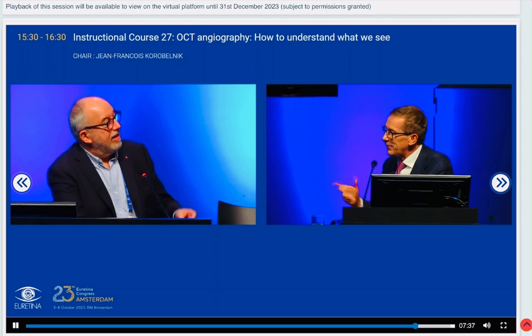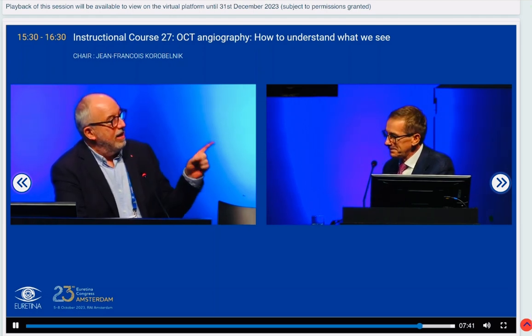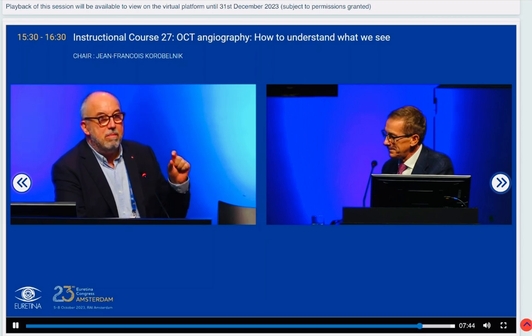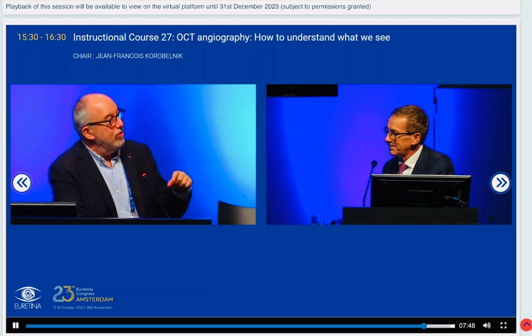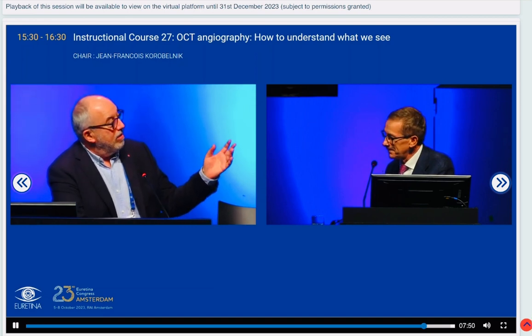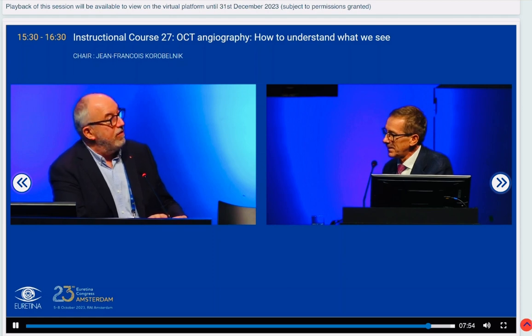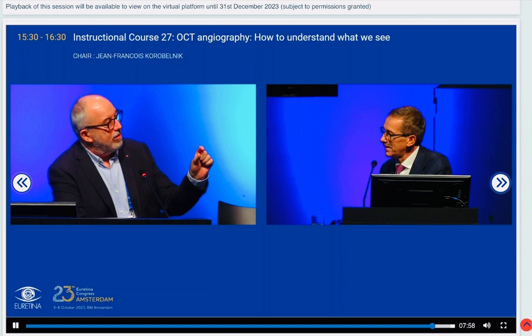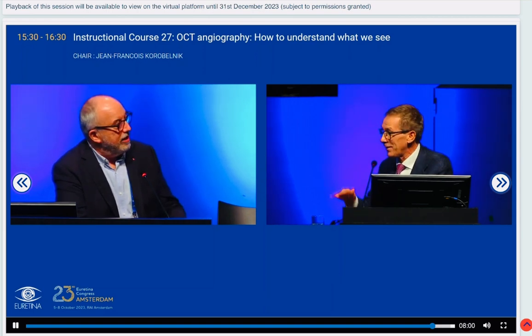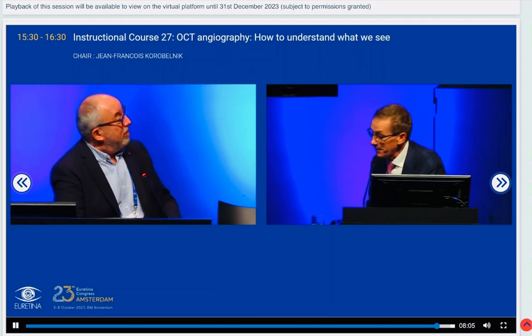Yeah. That's very important. I mean, if there's one thing you have to remember, it's what Giovanni said. The image is not the reality. It's the image of the reality, and you rely on the computer, all that is in the machine, to create that image. So you have to be very, very careful. That was amazing, your case where the vessel appears or disappears depending on the machine. Exactly. Yeah, and the segmentation. That's fantastic. Okay, Giovanni, thank you so much. Thank you.